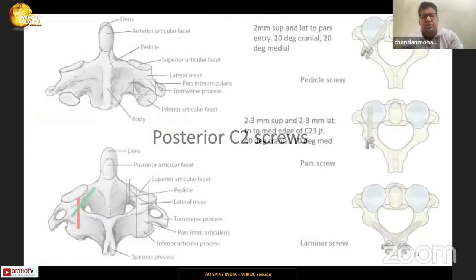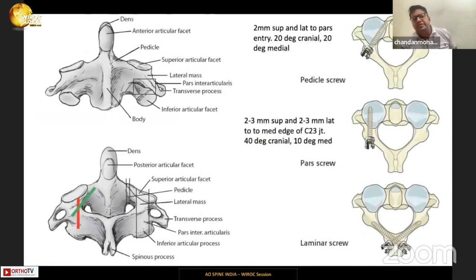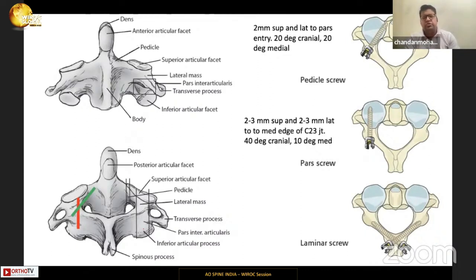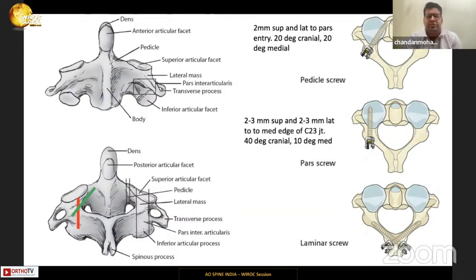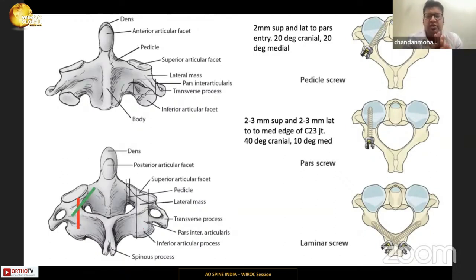The posterior C2 screws are of three main types: the C2 pedicle screw, the C2 pars screw, and the more recently described C2 translaminal screw. The C2 pars screw has its entry point about 3 mm superior and 3 mm lateral to the medial edge of the C2-C3 joint, with a much more cranial trajectory of about 40 degrees and very little or no medial angulation.